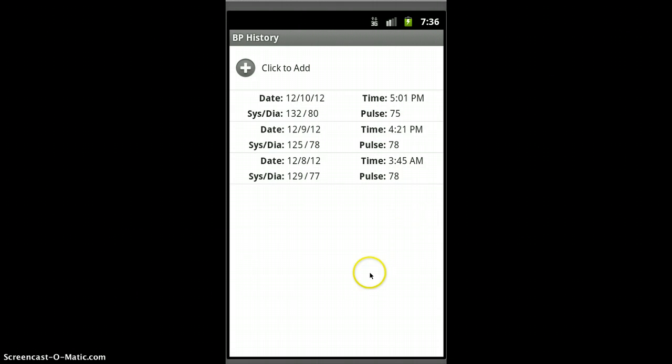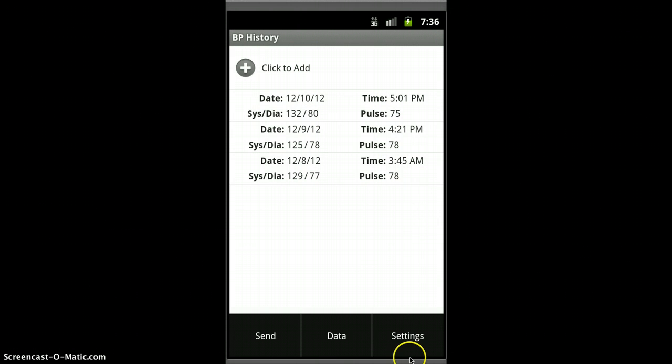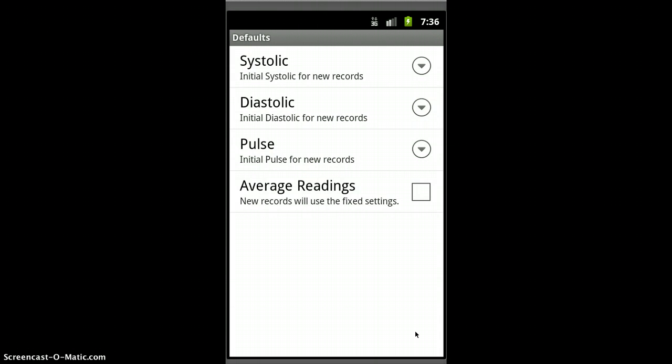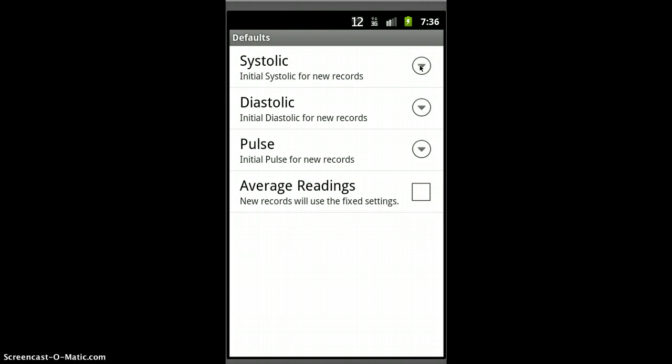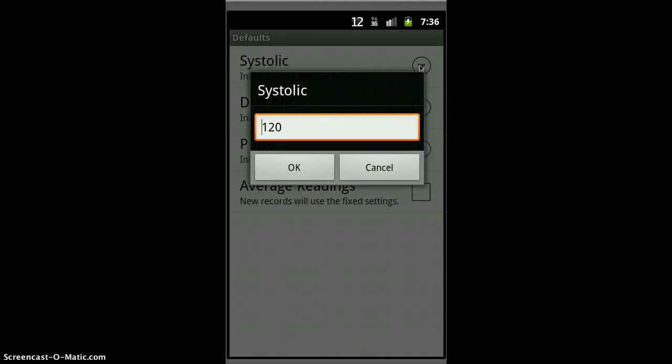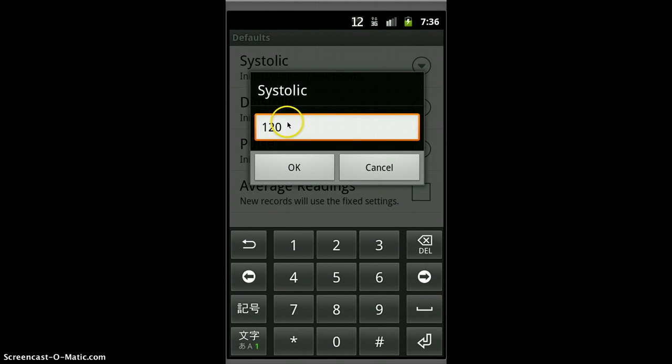And so finally, here's the new thing. I've added a settings page. What this is, is this is the value that you can choose for new records.